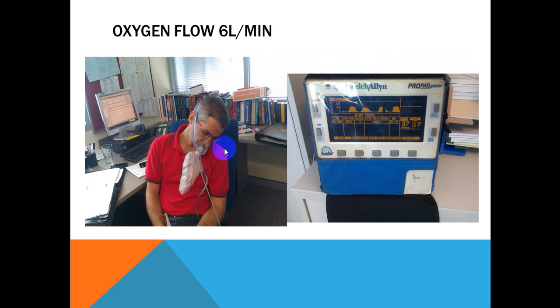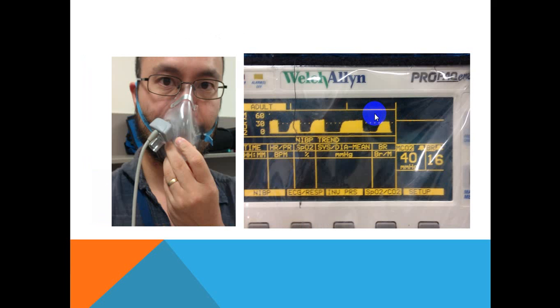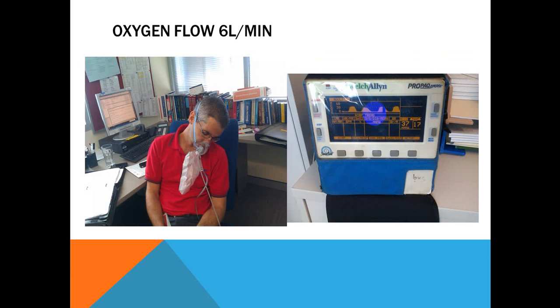This is Dr. Adam Pritchard, an ex-registrar, a resident friend of mine who's now graduated, demonstrating this setup here, pretending to be sedated, and this is the waveform that you get. We also ran 6 litres a minute of oxygen to demonstrate that it will degrade some of the waveform. If you compare this one where there is no oxygen versus this one where there's 6 litres, you see there is some degradation of the waveform, but the value actually doesn't change much at all.